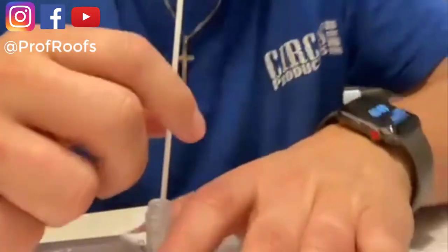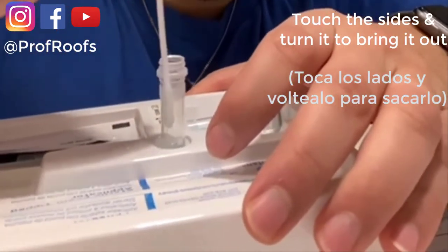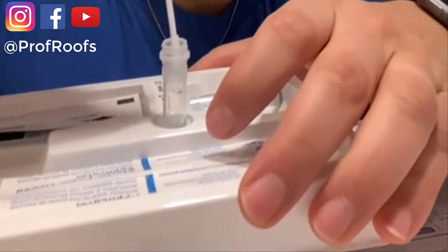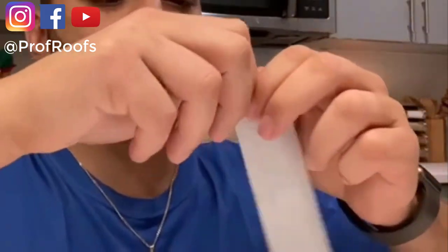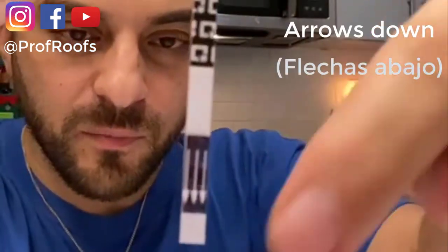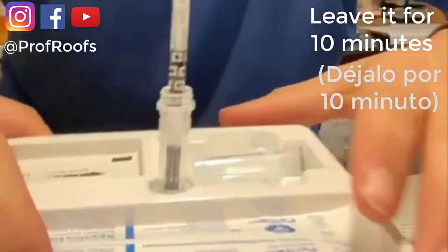Después de 1 minuto, 1 minute, lo vas a sacar, pero métalo para tocar los lados. Voltéala cuando lo sacas arriba. Ok, así, así. Y lo vas a botar. Throw it away. Una basura. Y después, esta. Ah, papelito. Lo vas a abrir. Creo que así. Y cuando lo sacas, parece así. Y dice, mira. Dice esa para abajo, después lo metas aquí y lo dejas por 10 minutos, así, right?